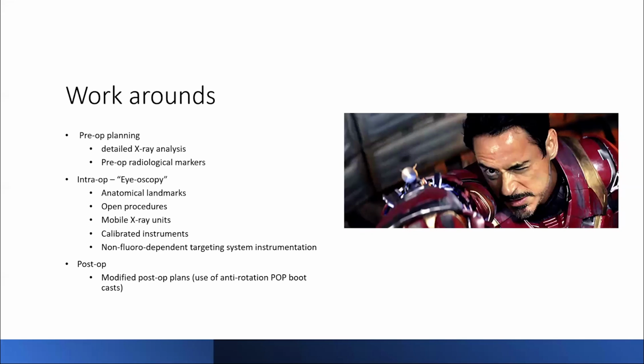And then there are non-fluoro dependent targeting instrument systems. The SIGN nail is one. We have used this. It's a bit like the workhorse for fracture and deformity correction surgery. And then post-operatively, modifying your post-operative plans, and this would be based on the type of surgery that you have done, essentially.